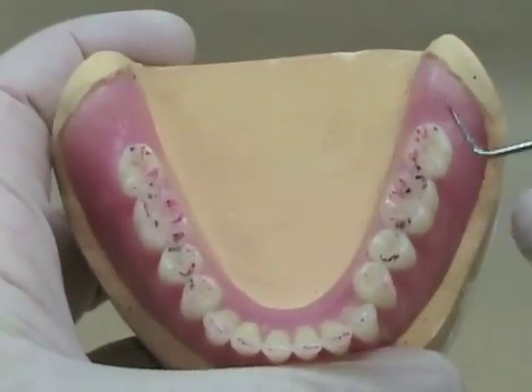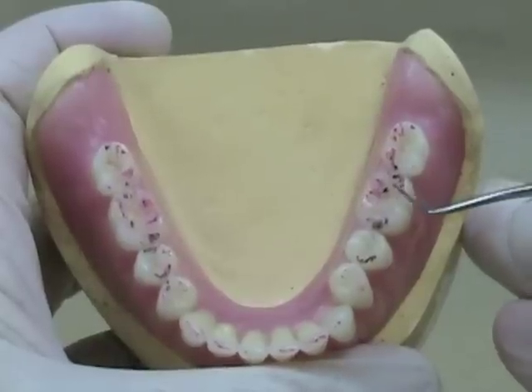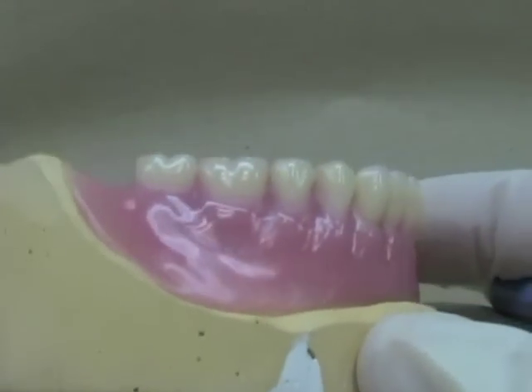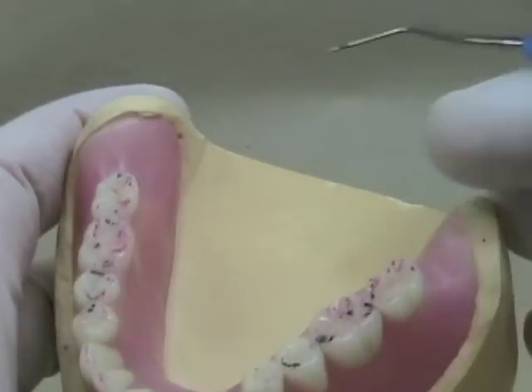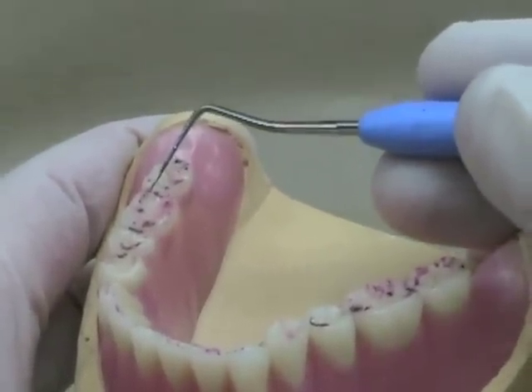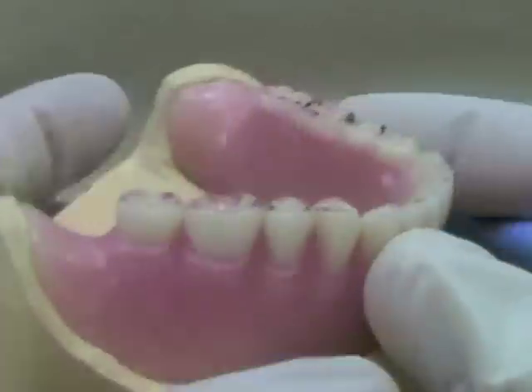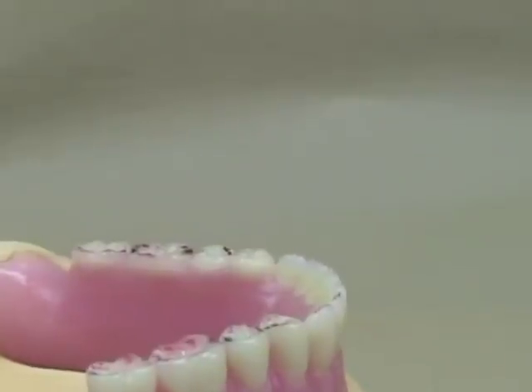In this fully finished and processed lower denture, you see the corresponding contacts. The black marks signifying our centric stops are centered either in the middle of a marginal ridge or the middle of a fossa on these zero-degree or cuspless teeth. It's important that those contacts be on flat areas — they shouldn't be on an incline. If they're off to the side, even on a cuspless tooth, they may end up on one of these inclines in the fossae of the teeth. All centric stops should be the maxillary lingual cusp to some sort of flat area on the corresponding mandibular tooth.